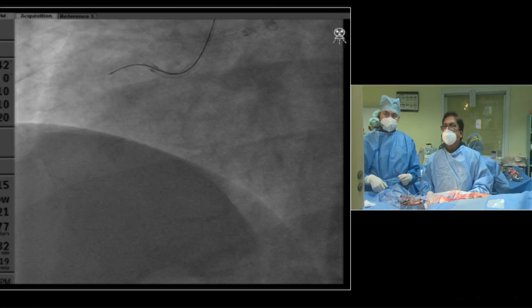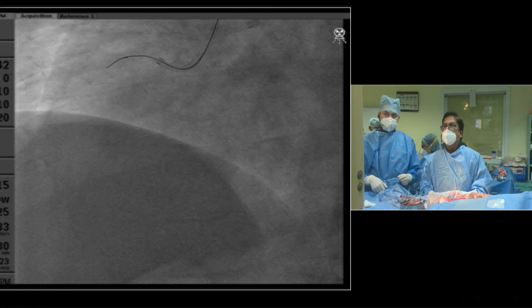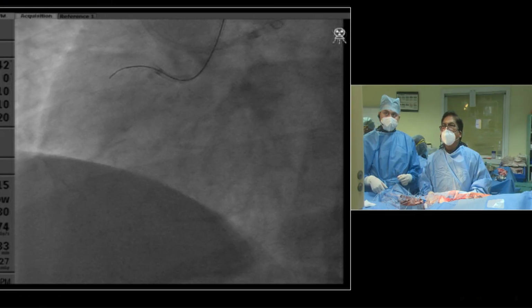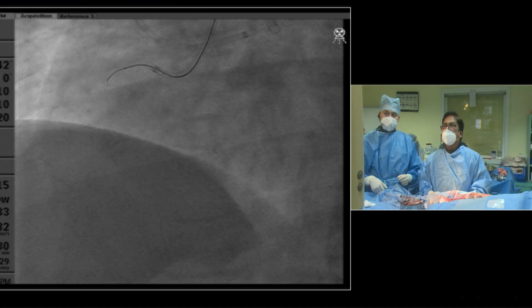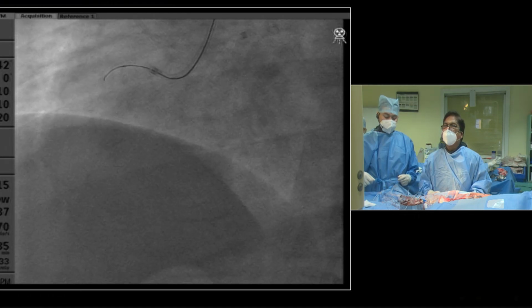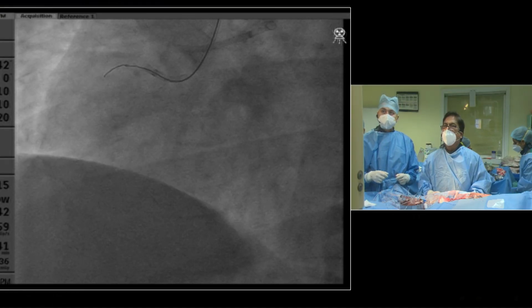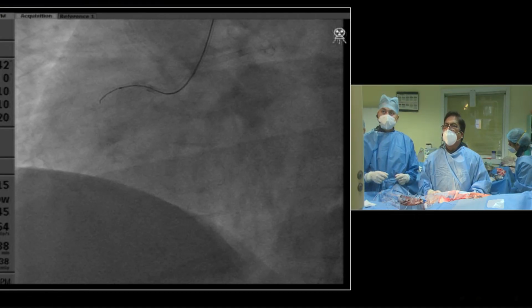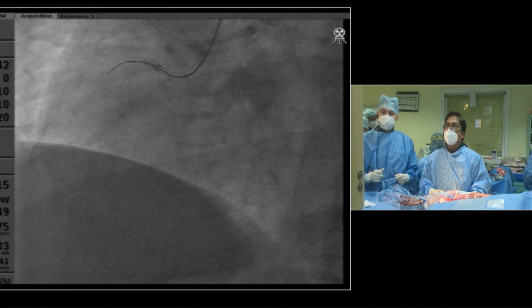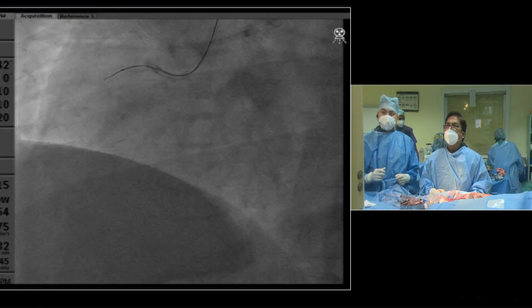Just a sec. It is not an easy one, you know, the side branch also creates a problem. I understand. I will tell you, actually, the chance of success in these types of cases is maximum 60%, not more than that, because all the negative things are there. The side branch occlusion, long occlusion more than 20 millimeters, a little tortuosity, and everything is against a favorable anatomy. So the perfect case to be kept for a live case, yeah.